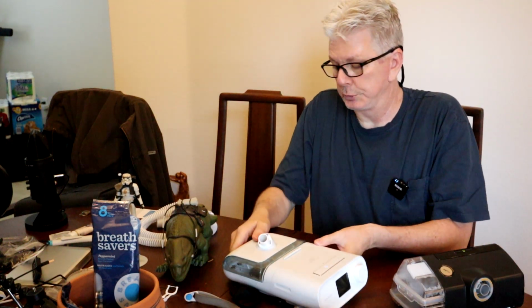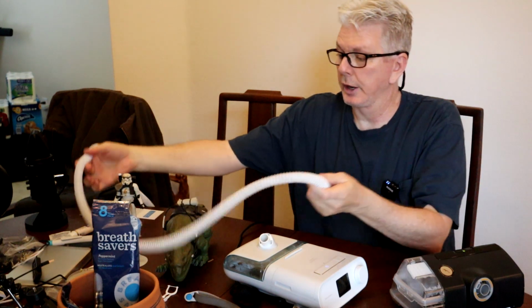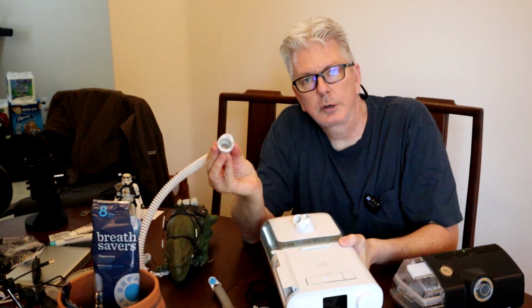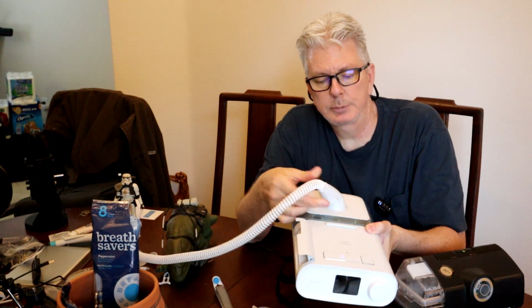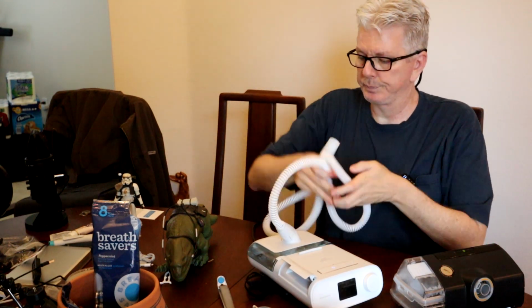They're both high quality machines. They're the top of the line for the auto CPAPs for each company. They both have the option to use heated tubing or standard tubing. I do heated tubing. That way I don't wake up so dry in the morning. So what I do is on the Philips, there's the three-pronged end that you just plug into the machine, and it snaps into place. And that's the heated tubing. Of course, you put the mask on.